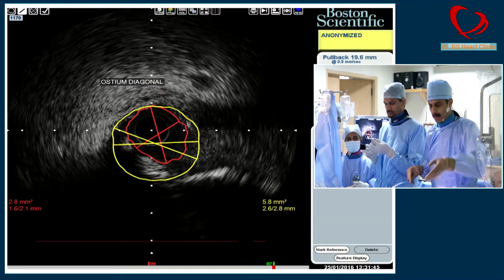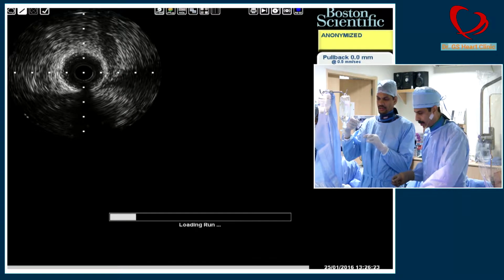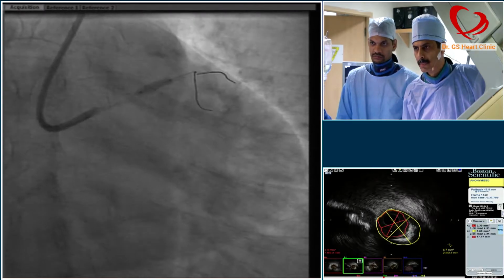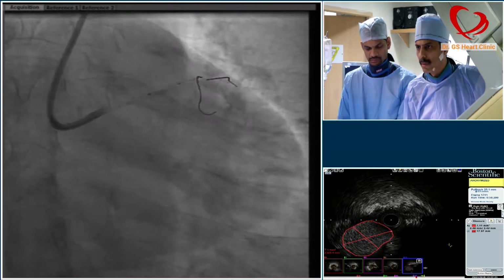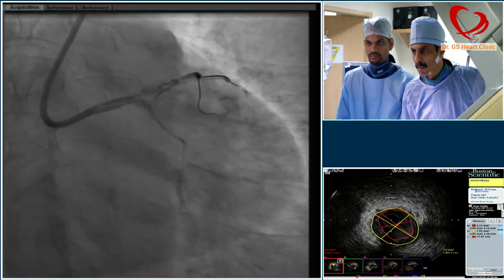So this is a 3 millimeter into 12. This is 312 NC Trek balloon. 6, 8, negative. Okay, give me a test. Wait, we will have to do it again, small test. Very small test. Oh, enough. All flap everywhere.